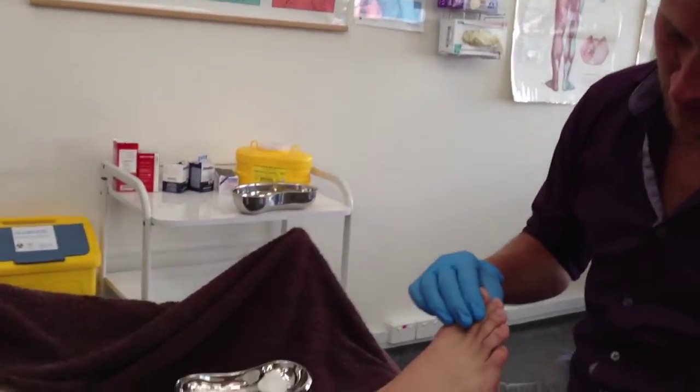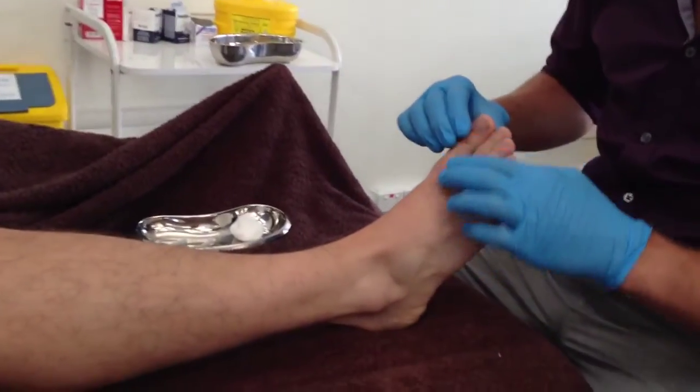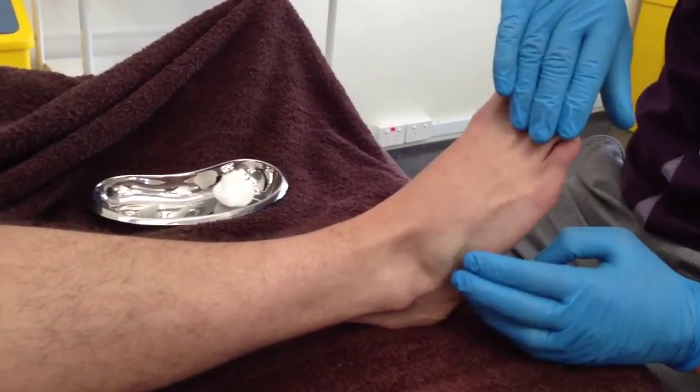With the patient in the supine position, the muscle bellies can be located through toe extension and flat palpation.